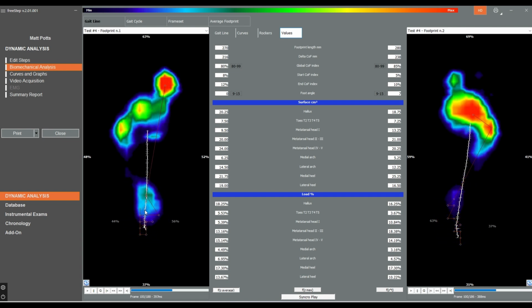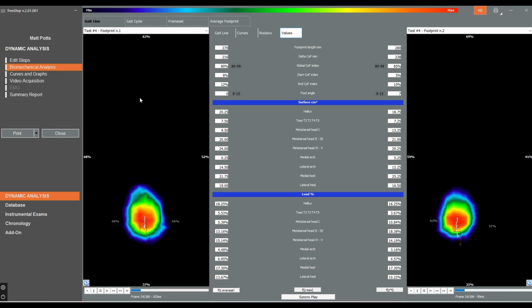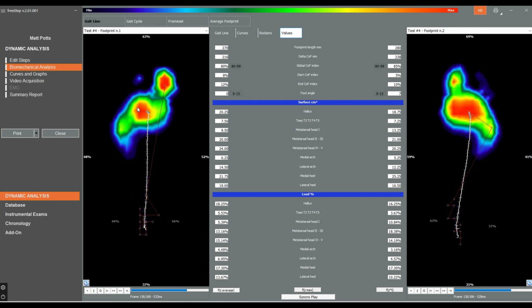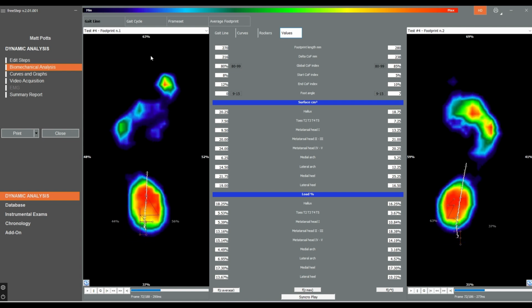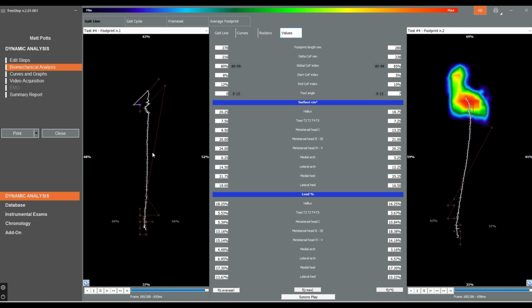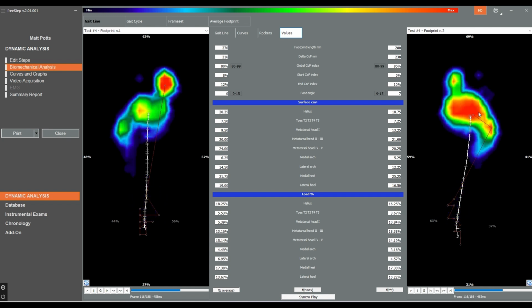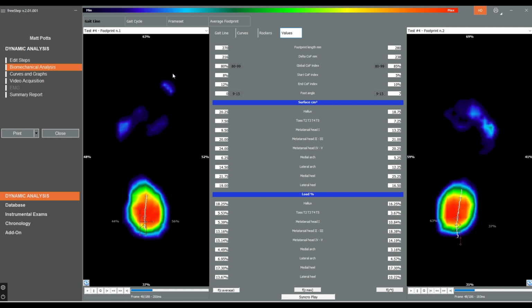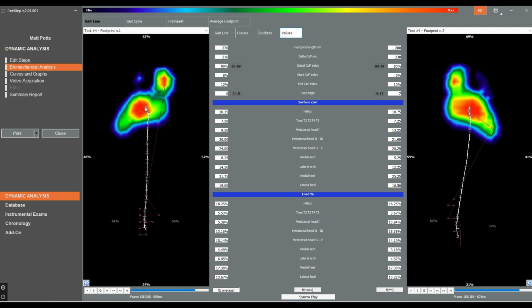It's very central, very straight, quite a lot of load in that central metatarsal area. And then the load almost looks like it backs off and does a loop backwards, if you can see that. So there isn't a real push through the toe. Now, from my experience, I have overpronation quite predominantly bilaterally. So we'll have a look at the right one separately. But also some stiffness from lots of running in the past in this toe. So I'm obviously trying to take the pressure back off that.